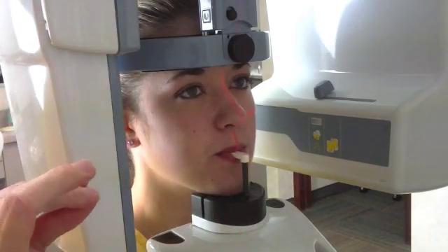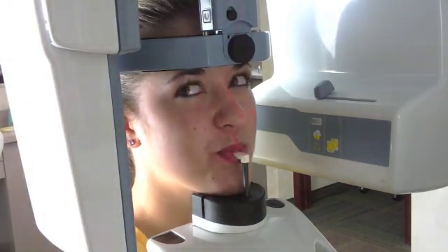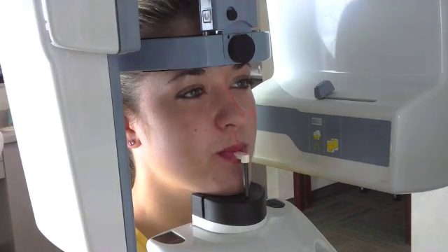Once that's centered, we have the patient put their lips around the white piece that they're biting on. They bring their tongue to the roof of their mouth, and then their only job is to stay nice and still.